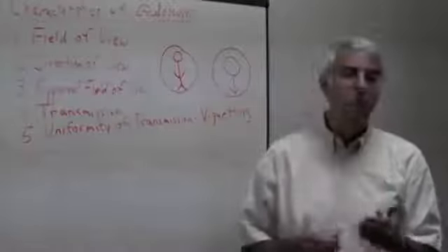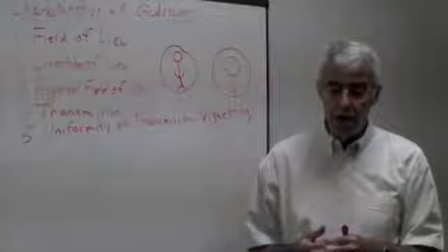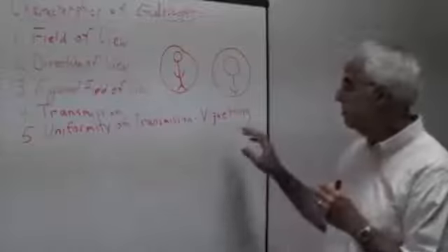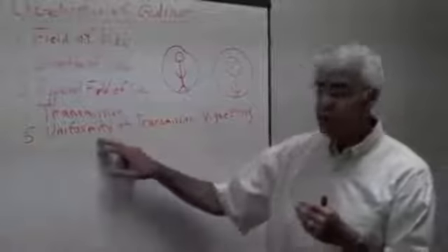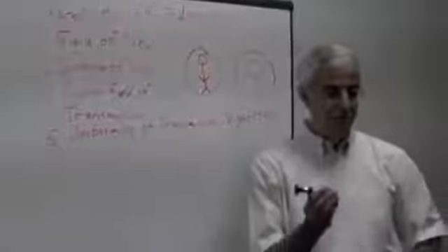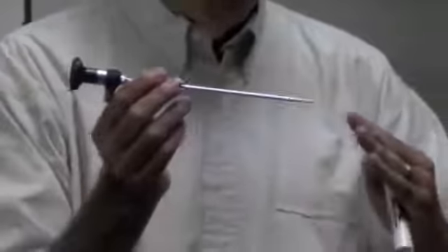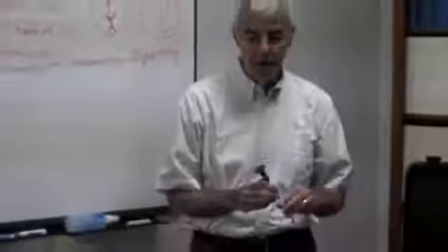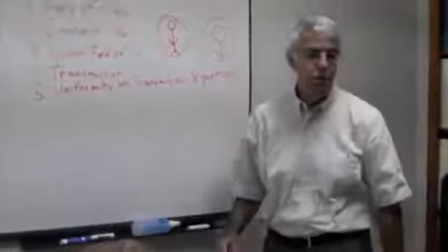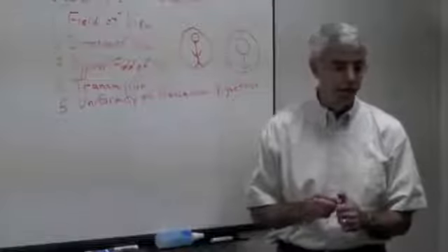So this is actually a very difficult part of the optical designer's task when they're designing an endoscope, to have a very small level of vignetting, which translates to a high uniformity of the transmission. You can think about it kind of logically. If I'm putting the light through here and it's going straight through the lenses, that's a lot easier than getting all the light that's going up and down, getting through the lens system. And it's the lens designer's job to reduce the amount of vignetting to a small value.